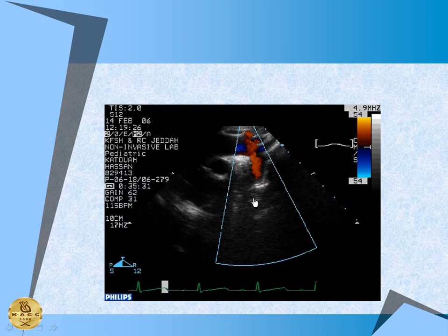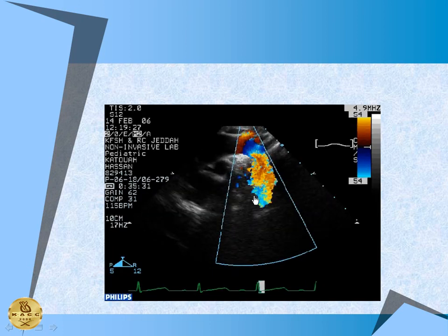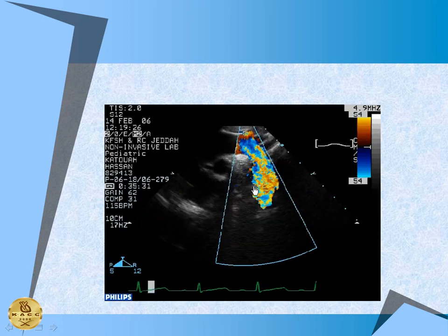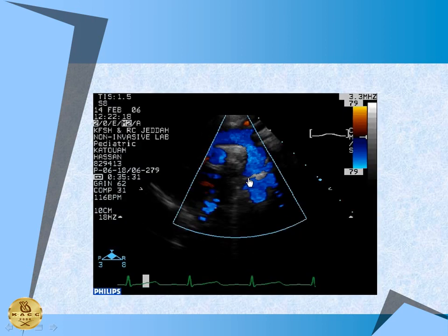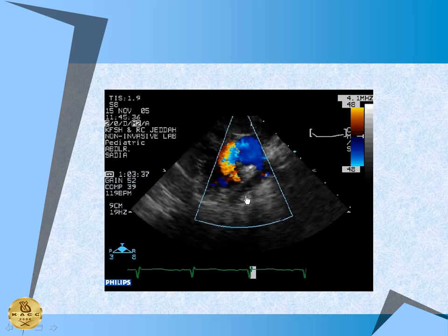Is there? We'll see. Well, this patient does not have one, because we're way below. You see again, way below. But we'll give you things that can show. This is again the same patient.